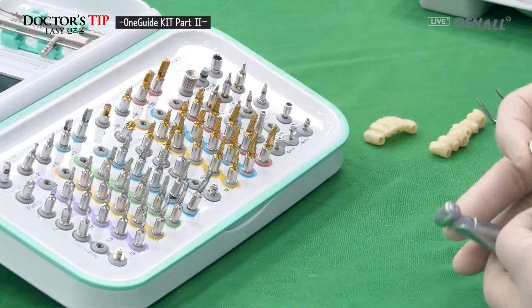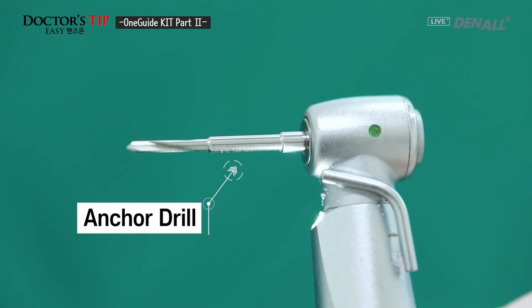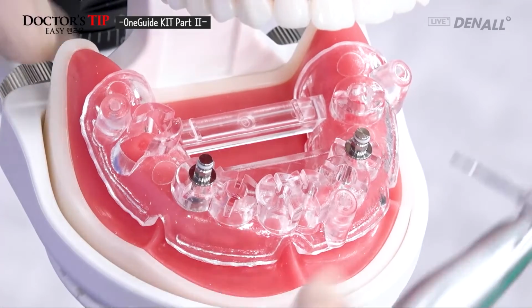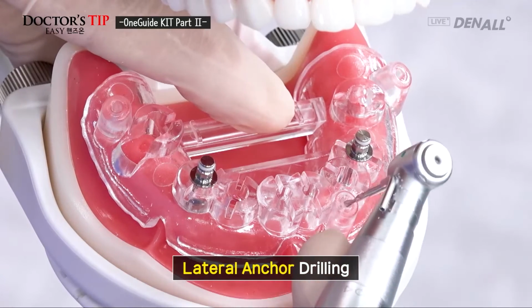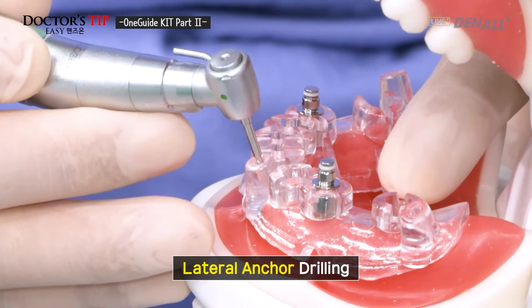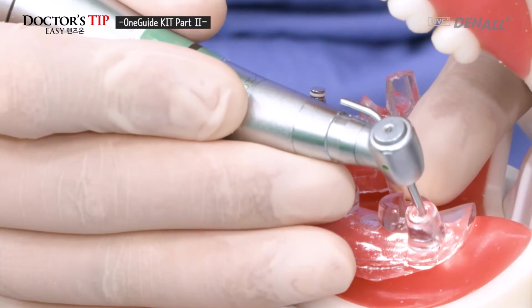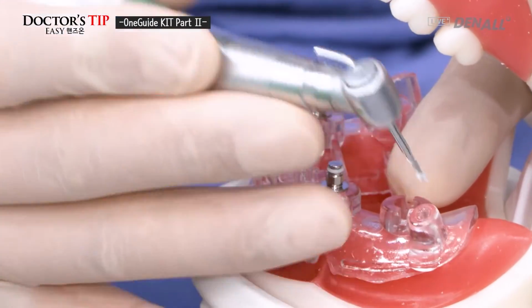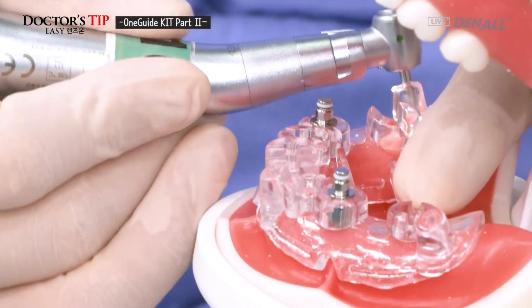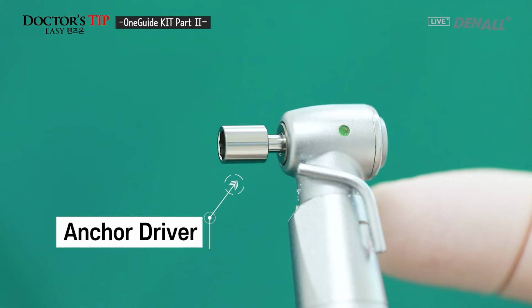I'm going to connect anchor drill. There are 3 sites for lateral anchor. Drilling is now going to be done on the anchor site. As shown, number 30, posterior side, anchor drilling is done. Number 40, anchor drill is being done. Now it's mounted. You're going to connect the driver for anchor.